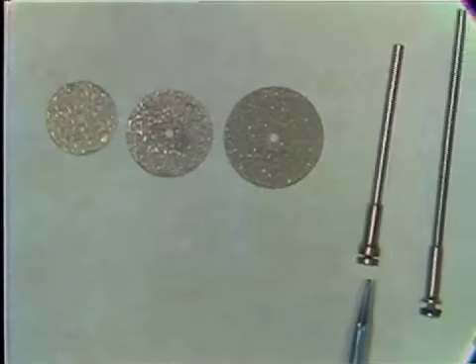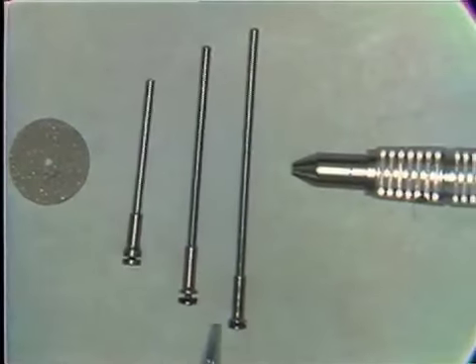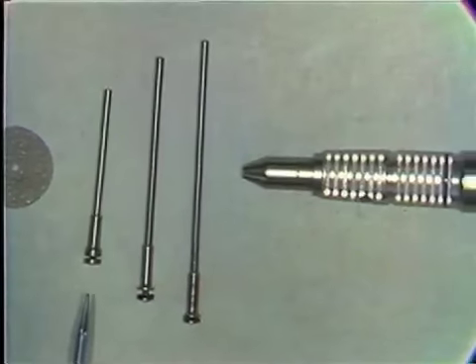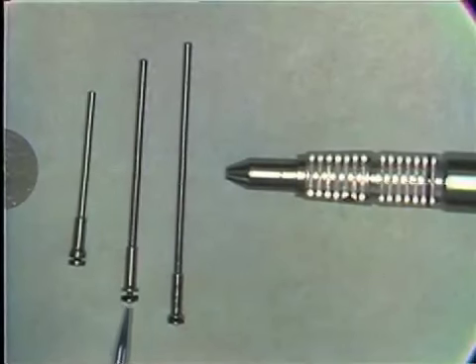There are again 3 sizes of mandrels in the kits. The first is a 2-inch mandrel, the second 2.5 inch, and the third a 3 inch. It is suggested that you measure these mandrels so that you know which one you are using. The preferred mandrel is the 2.5 inch length.